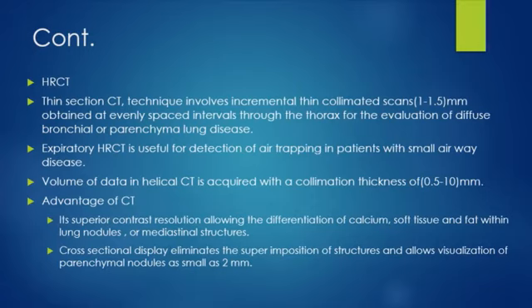Regarding the advantages of CT, it has superior contrast resolution, allowing the differentiation of calcium, soft tissue, and fat within lung nodules or mediastinal structures. Cross-sectional display eliminates the superimposition of structures and allows visualization of parenchymal nodules as small as 2 millimeters.